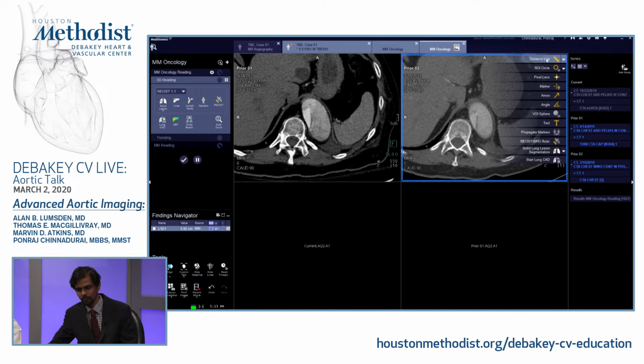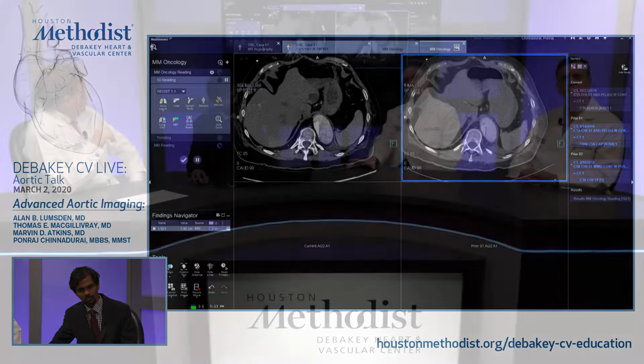So with these two data sets, what do you tend to use as your anatomic landmarks to mark them as at the same level? So this is done completely automatically. I can readjust it if it is off, but it seems pretty close even by looking at the shape of the vertebral level. If not, you use the PA bifurcations, or you use bony landmarks?